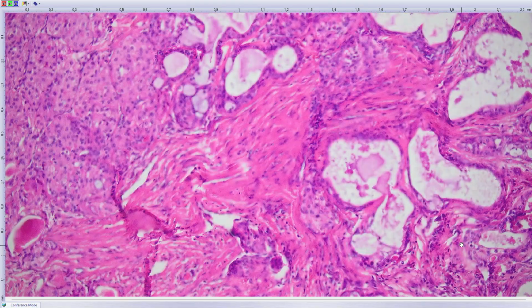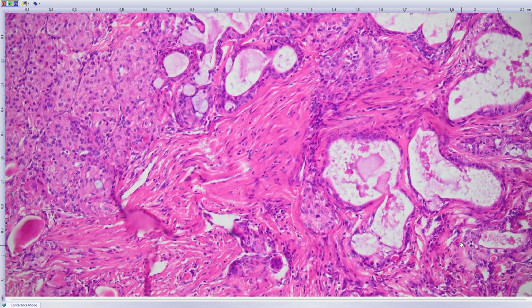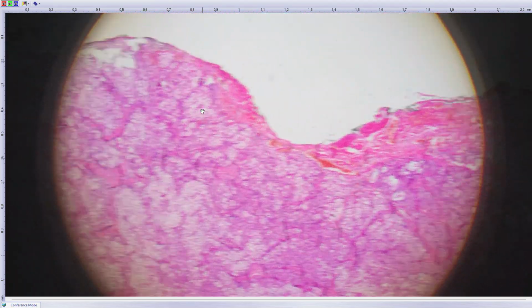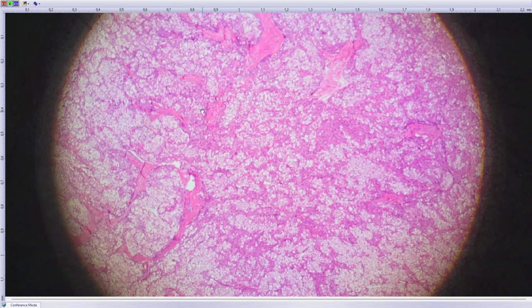If we start to think about the correct diagnosis, you start to see cells which are not foamy histiocytes but actually mucocytes. So the final diagnosis was mucoepidermoid carcinoma, clear cell variant, and the diagnosis was confirmed by finding the appropriate fusion, which in this case was CRTC1-MAML2. This diagnosis is quite nice, I believe.